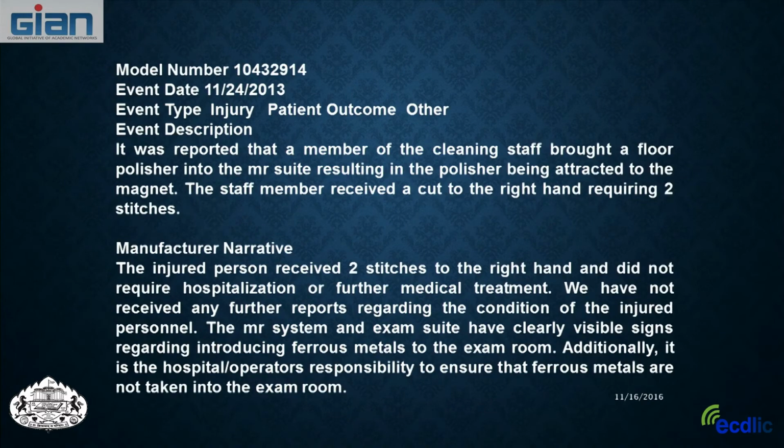Okay, here's a report of a member of the cleaning staff bringing a floor polisher into the MRI suite, resulting in the polisher being attracted to the magnet. The staff member received a cut to the right hand requiring 2 stitches, and did not require hospitalization or further treatment.